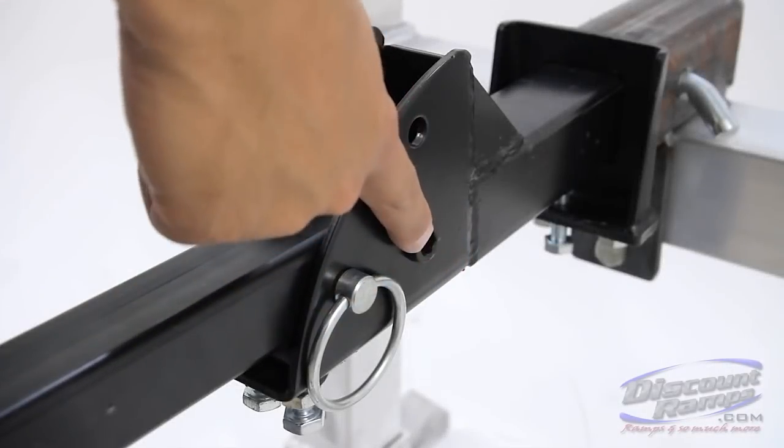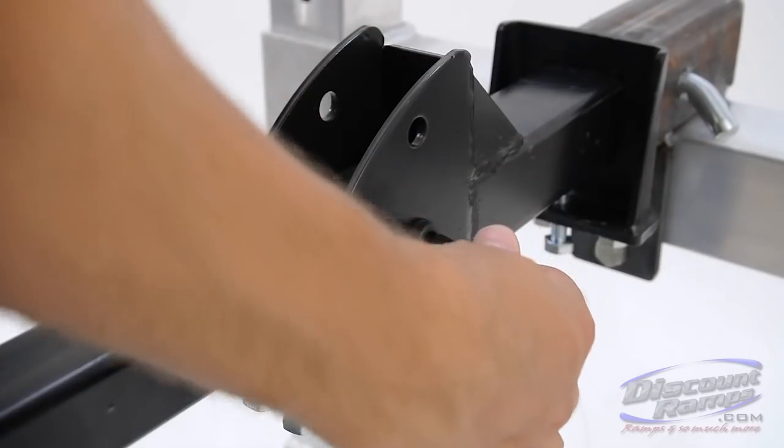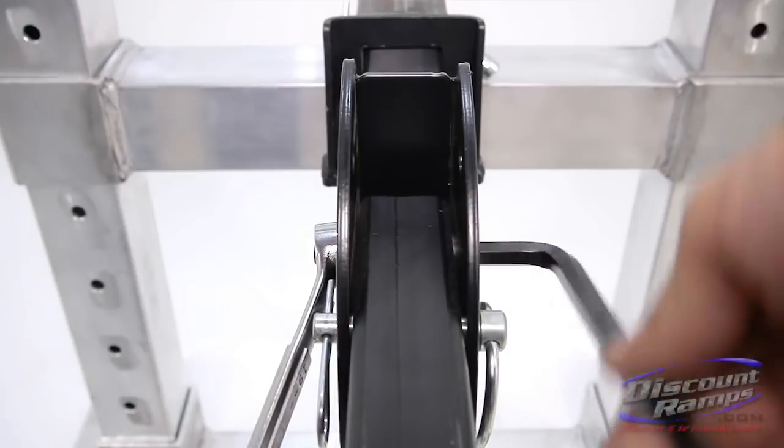To help eliminate the folding hitch tube wobble, tighten the hex head pivot bolt. Do not over-tighten. If over-tightened, the carrier will not be able to pivot or swing up properly.